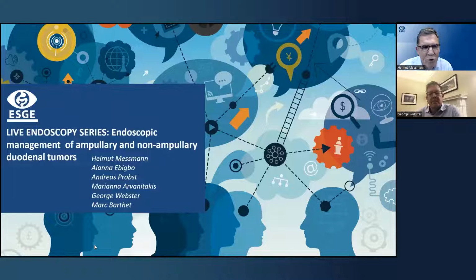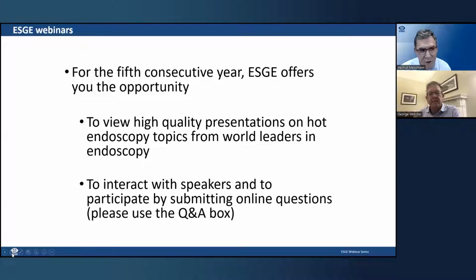And today we would like to start with a topic on duodenal adenoma, and you have the chance to ask questions, answers. Please use the chat function, and I would like to share my screen and welcome George. Thank you for supporting this idea.